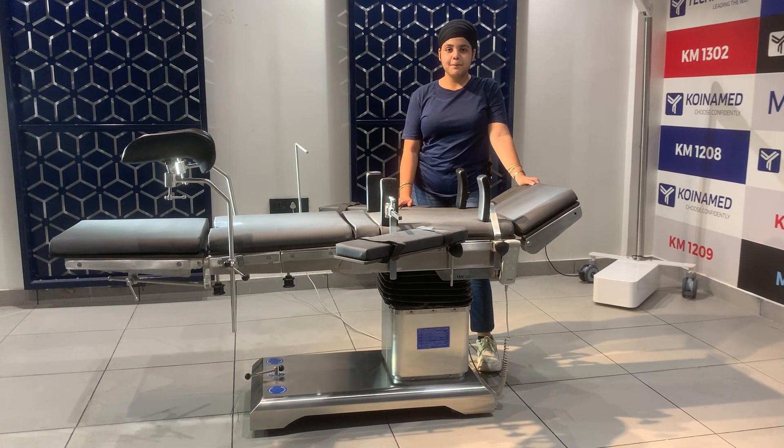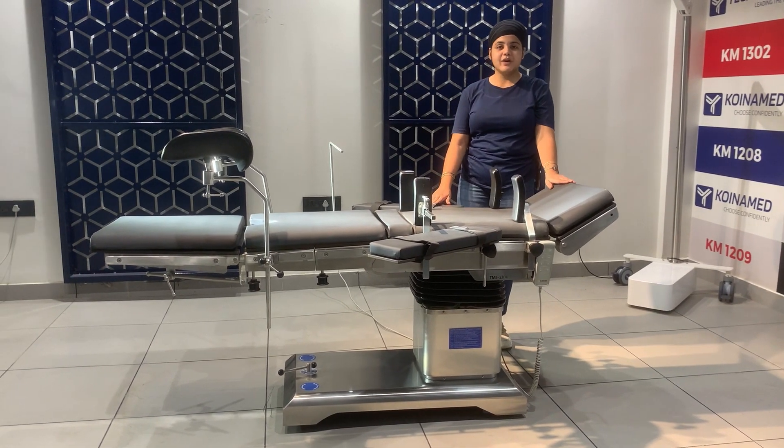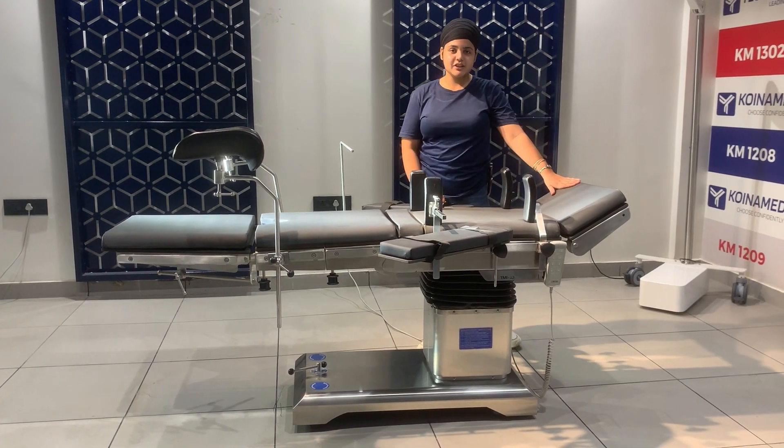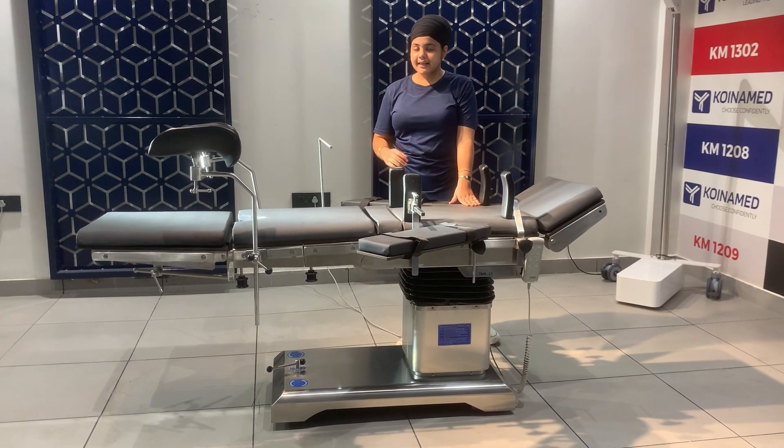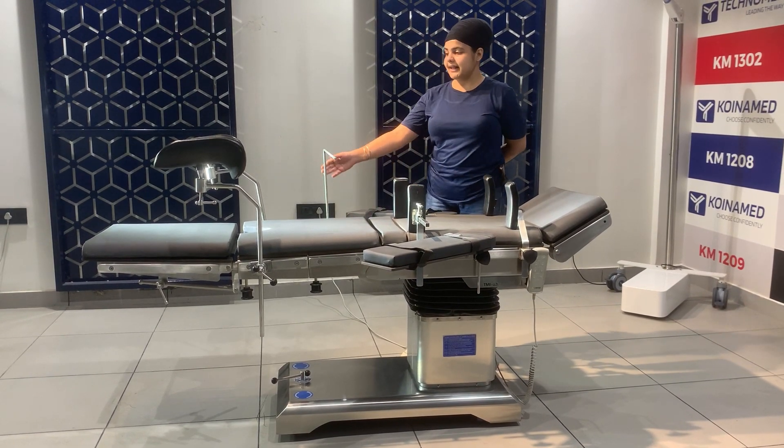This is our C-arm compatible and centric pillar OT Table. The table has a 5-section top: head section, back section, kidney bridge, pelvic section with a perineal cut, and the leg section.